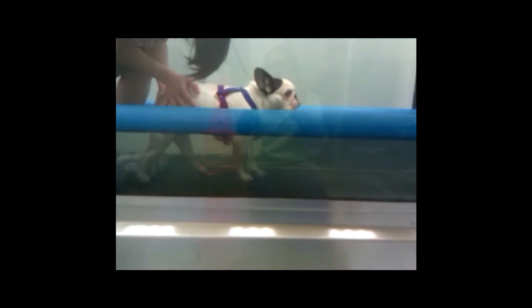Zoe is starting to show some movement in her rear limb herself. She can't place, but she's definitely feeling it — she's lifting her leg up and placing it as she's walking. I'm very happy with that; that's over the weekend that I'm noticing some progress. I'm giving her a hand over her rear end to keep her from sliding backwards from the motion on the treadmill. You can see she's got some mobility and she's really trying to move her legs herself. My right leg here moves all the way back and then she lifts it forward, left leg goes back and then she lifts it forward herself.